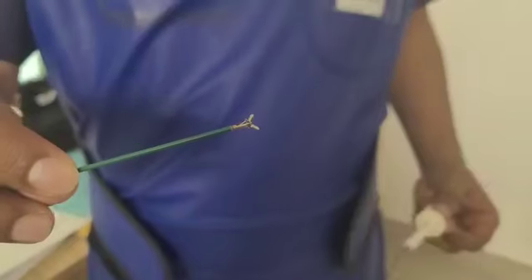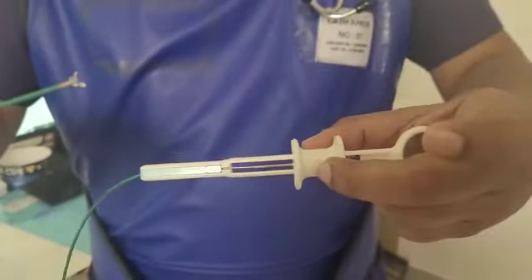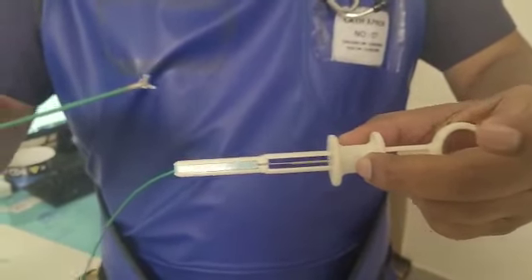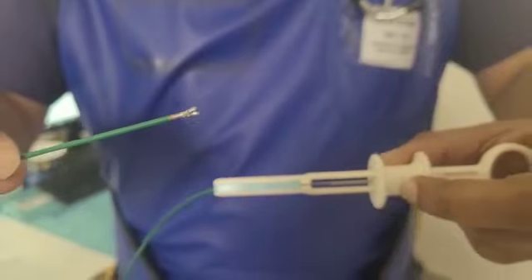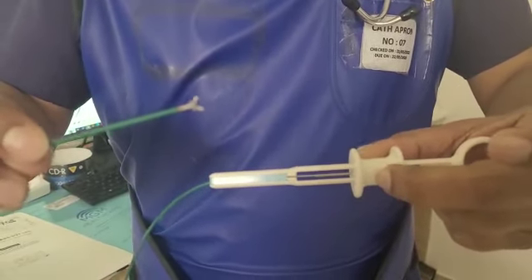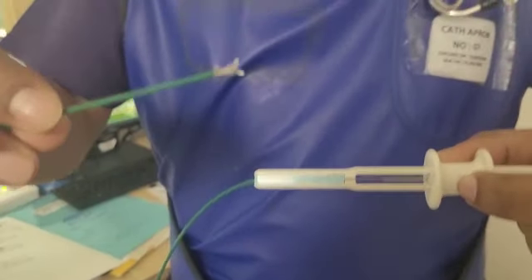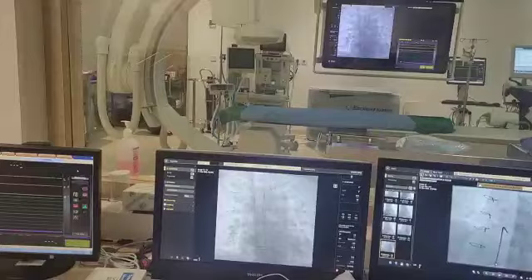This is done 3 weeks after a heart transplant, and it's also done every year along with a coronary angiogram. So this is a bioptome, and that's how my colleague is pulling it back, and here you can see the bioptome opening. You pick up the piece of the tissue, and then you eventually close it and remove it for the analysis of the tissue.